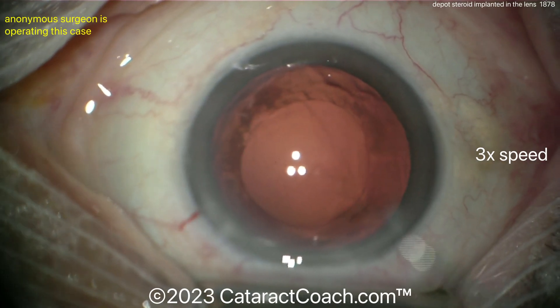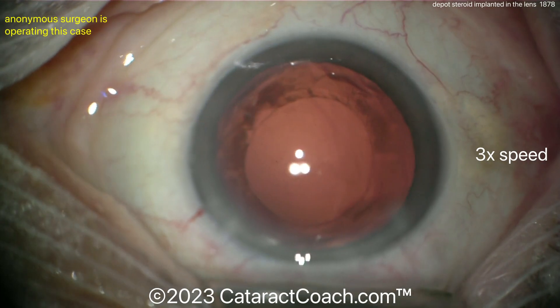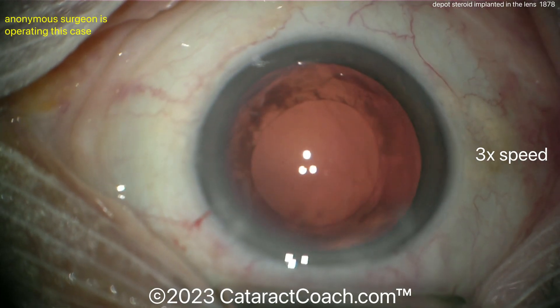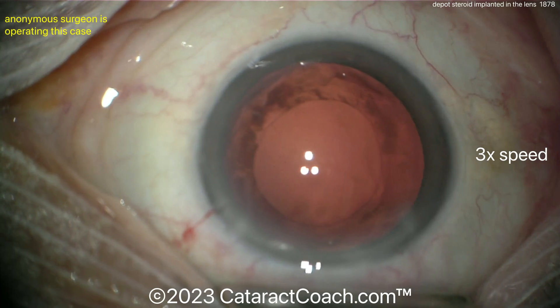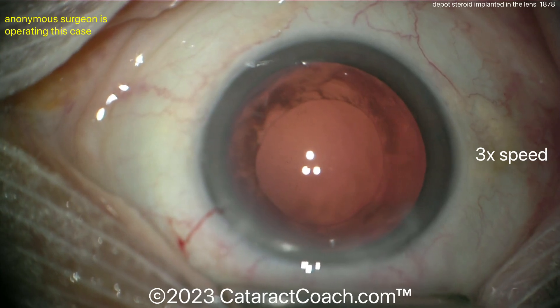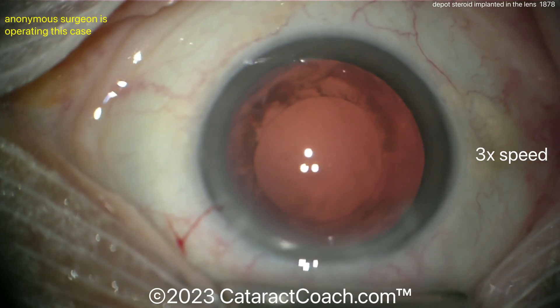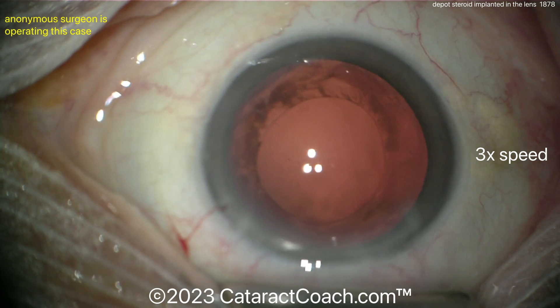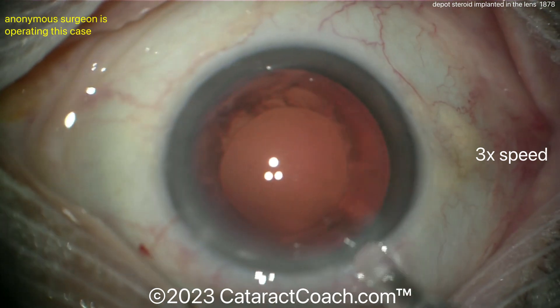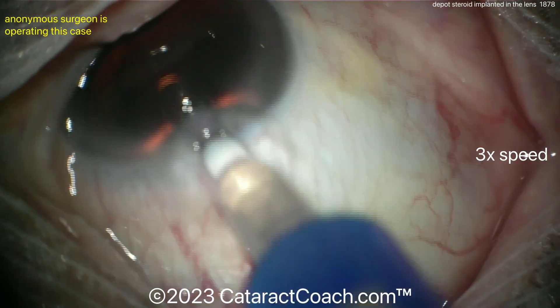Here's the viscoelastic going inside the eye. I'm still wondering where that capsule defect is — it's probably somewhere along the path where the implant first was, maybe around the seven o'clock position on screen, but I don't see a big defect. I'd be very tempted to put a three-piece lens in the sulcus with optic capture, just because I'm unsure of the bag integrity — but you could try a single-piece lens in the capsular bag.